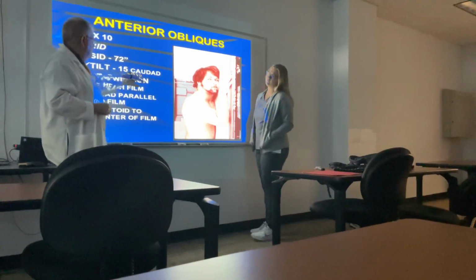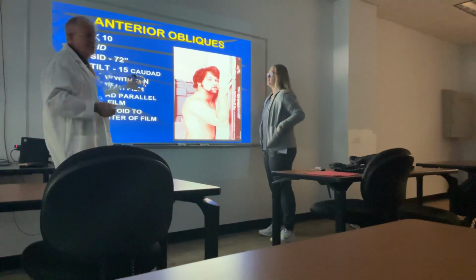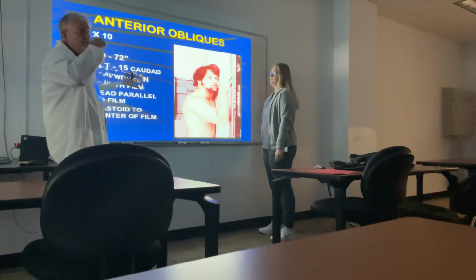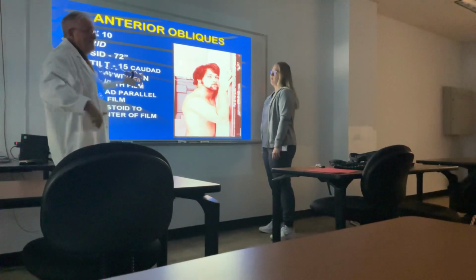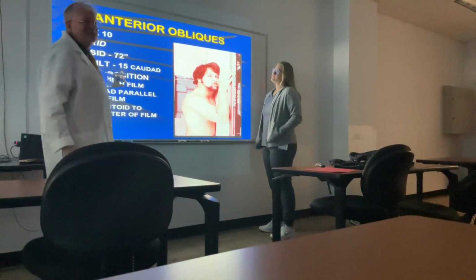It goes 10 to 15 degrees, should be just 15, so it's consistent with everything else we do. 10 to 15 degrees, which way? Caudad. I know caudad, what does that mean? The tail, as in cauda equina, tail, down, okay? And you want to put another mark, it's the only one that goes down.